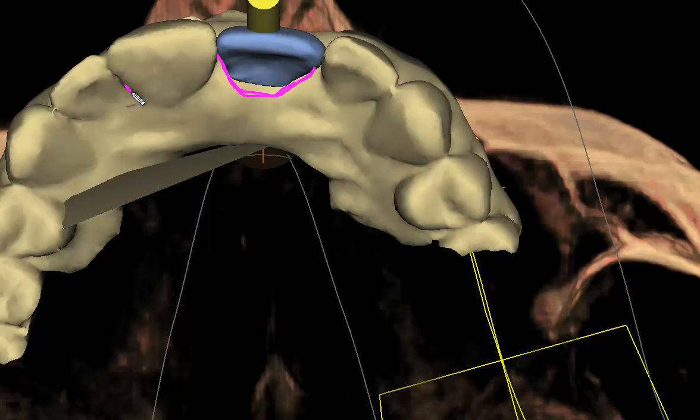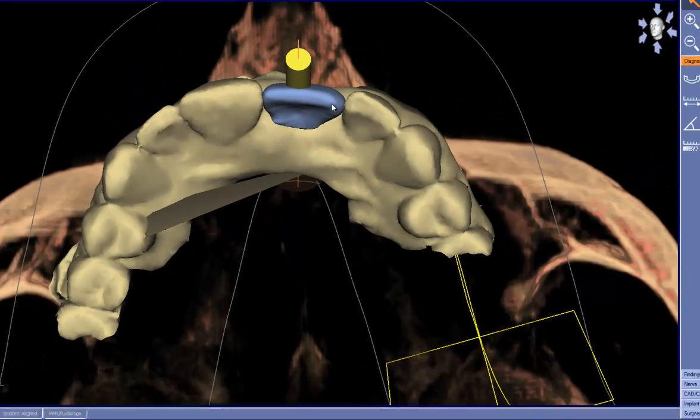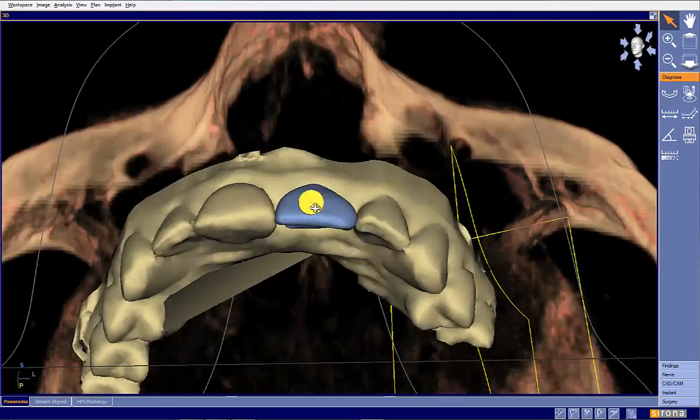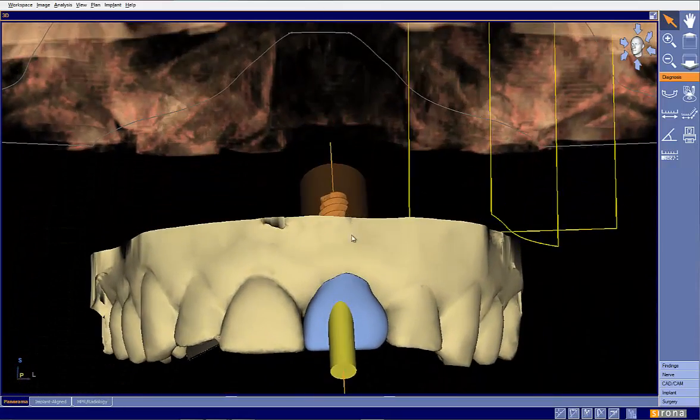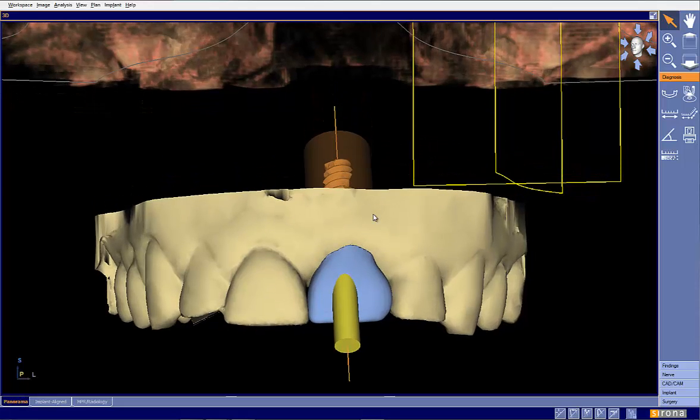And it's always good to look at your neighboring tooth to be able to see. Now again, I'm being particular, but it is this particularness that gives us the great results, which is what we all want. So in an ideal world, we'd like to see this come out just like so. Now if we take the same thing and look at it from the facial, we look pretty good here, okay?